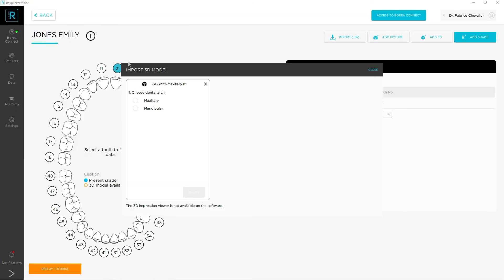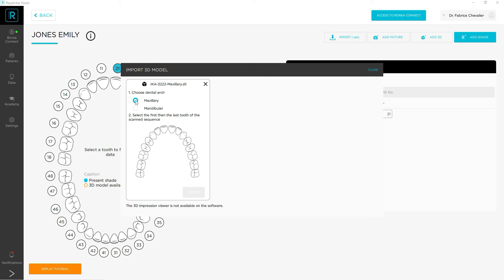You will then be asked to select the arch you wish to upload. Check the corresponding box. Its drawing will appear next, then select the scanned sequence and click on the Import button.